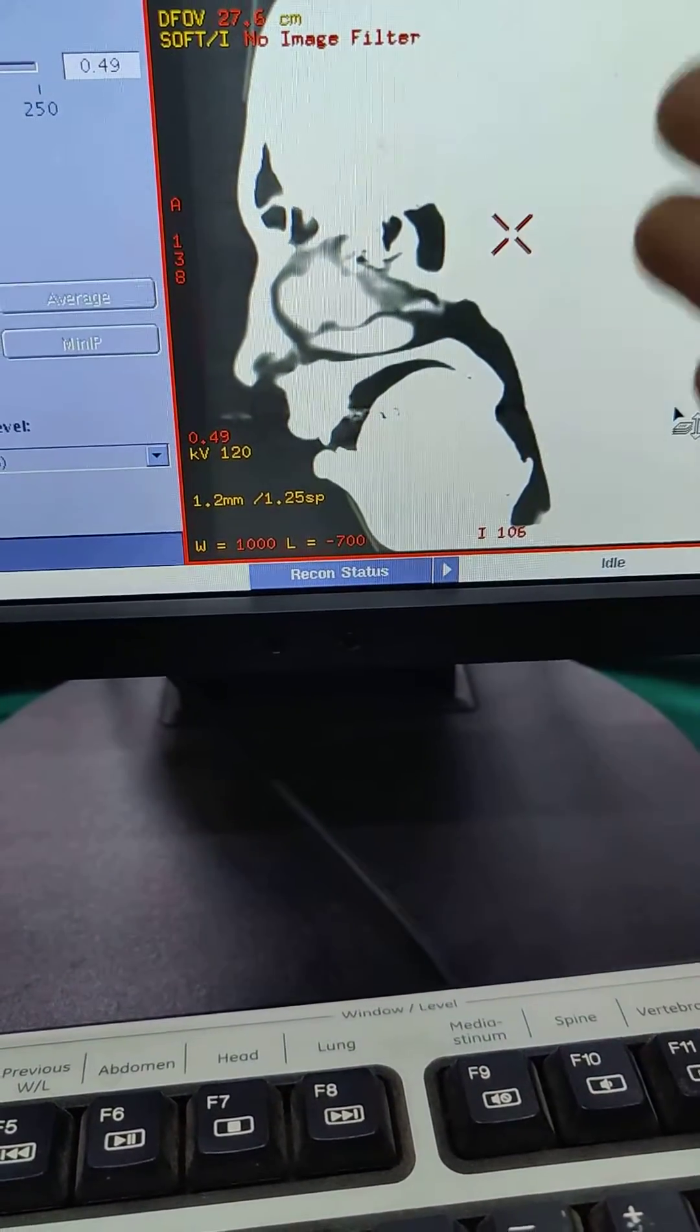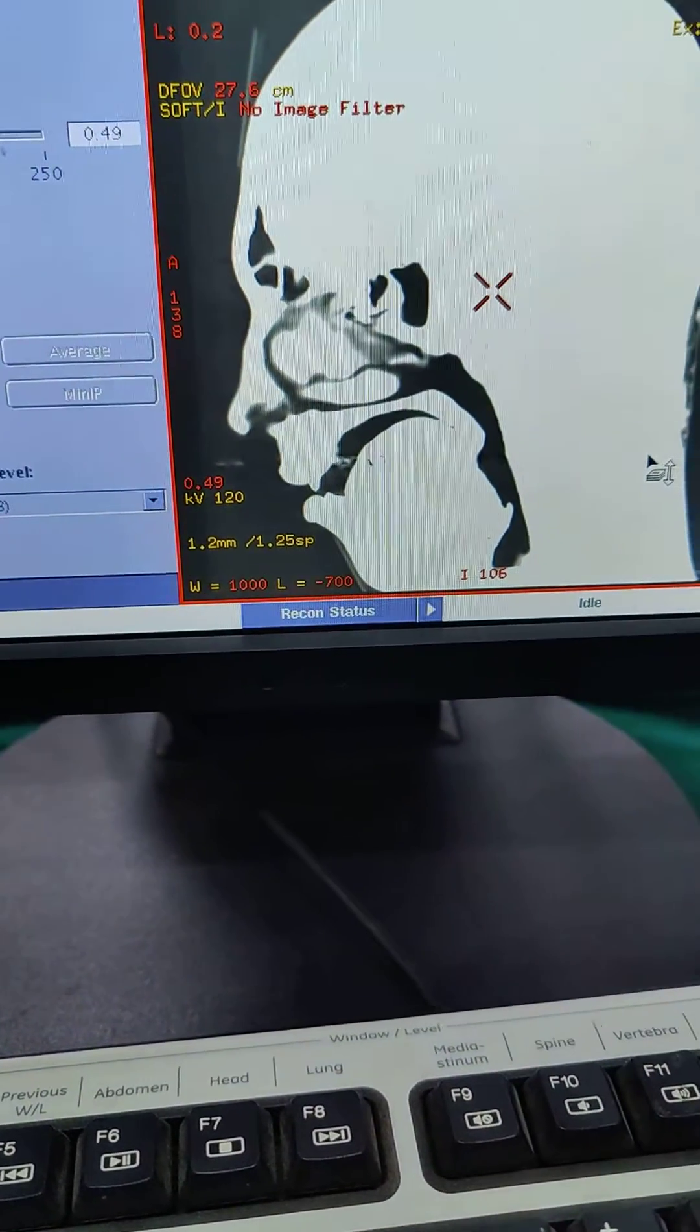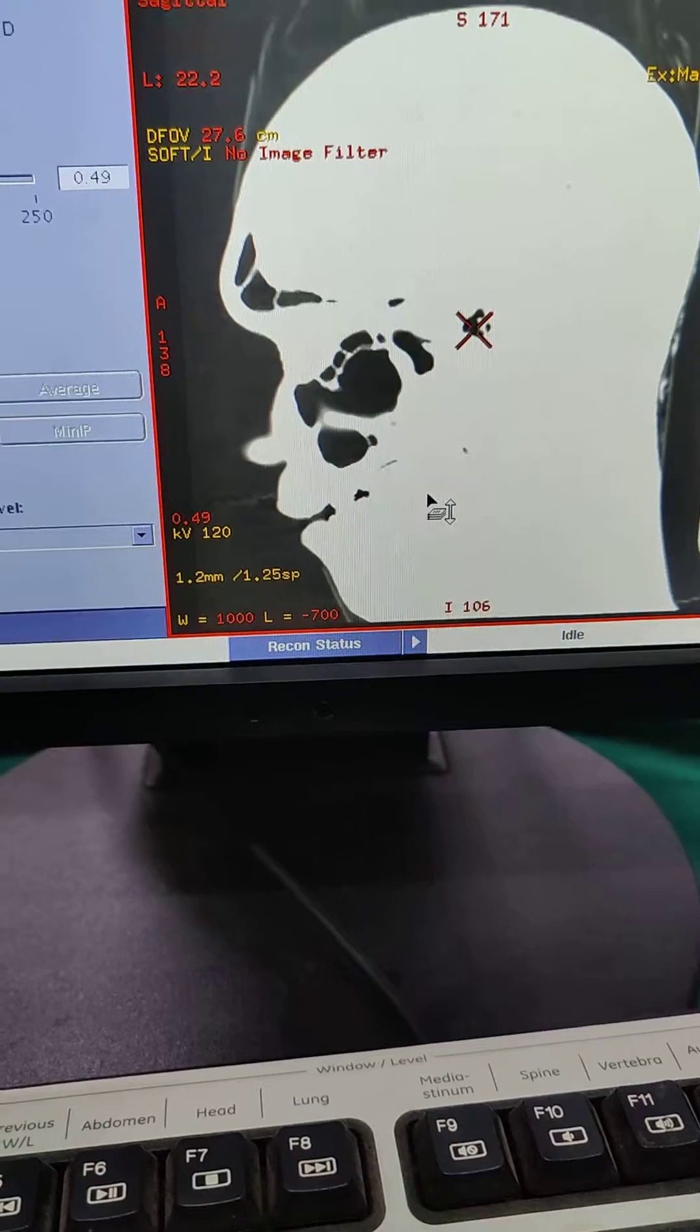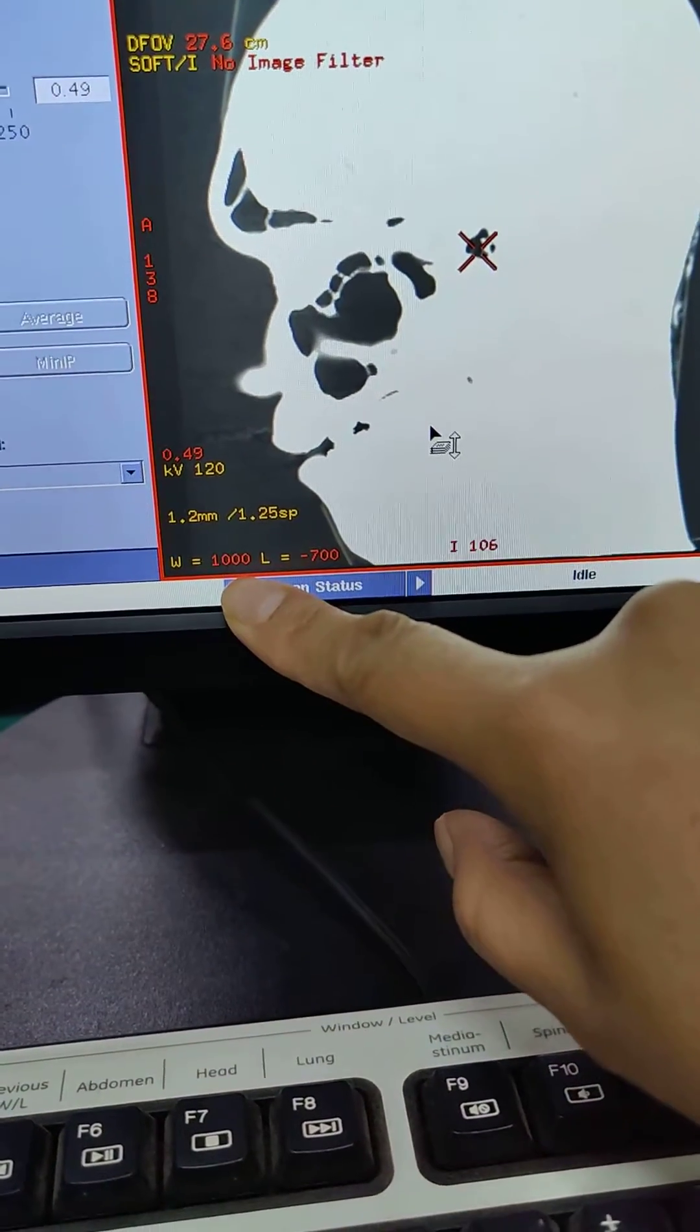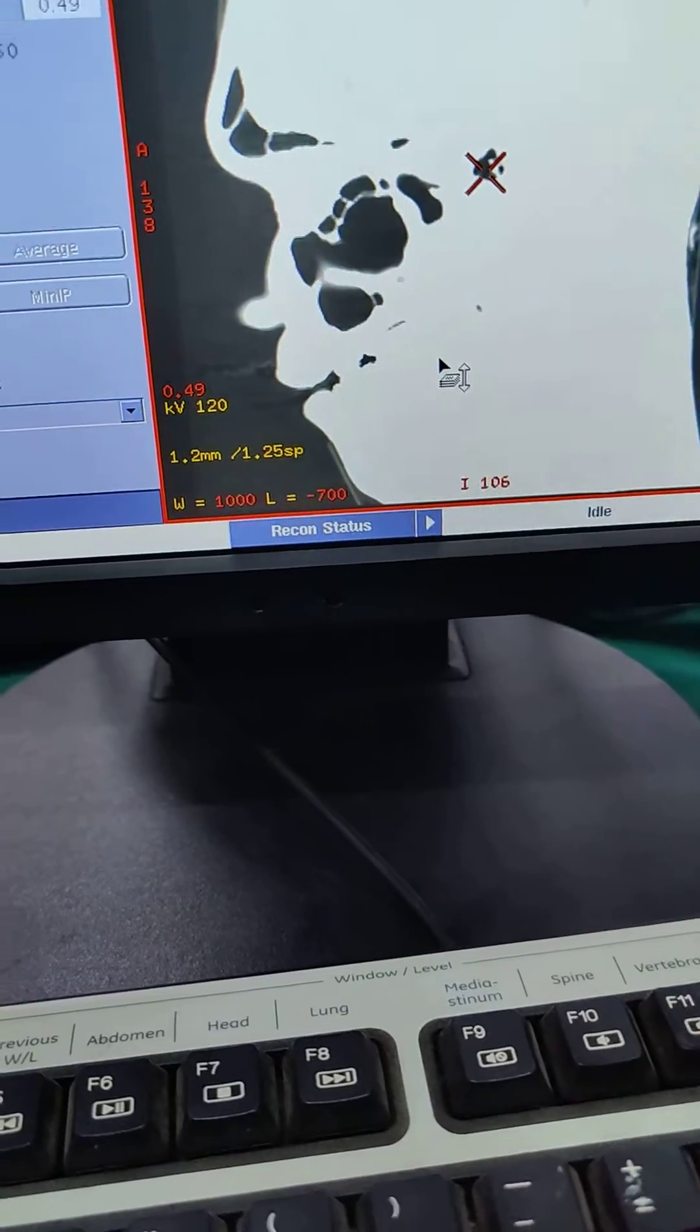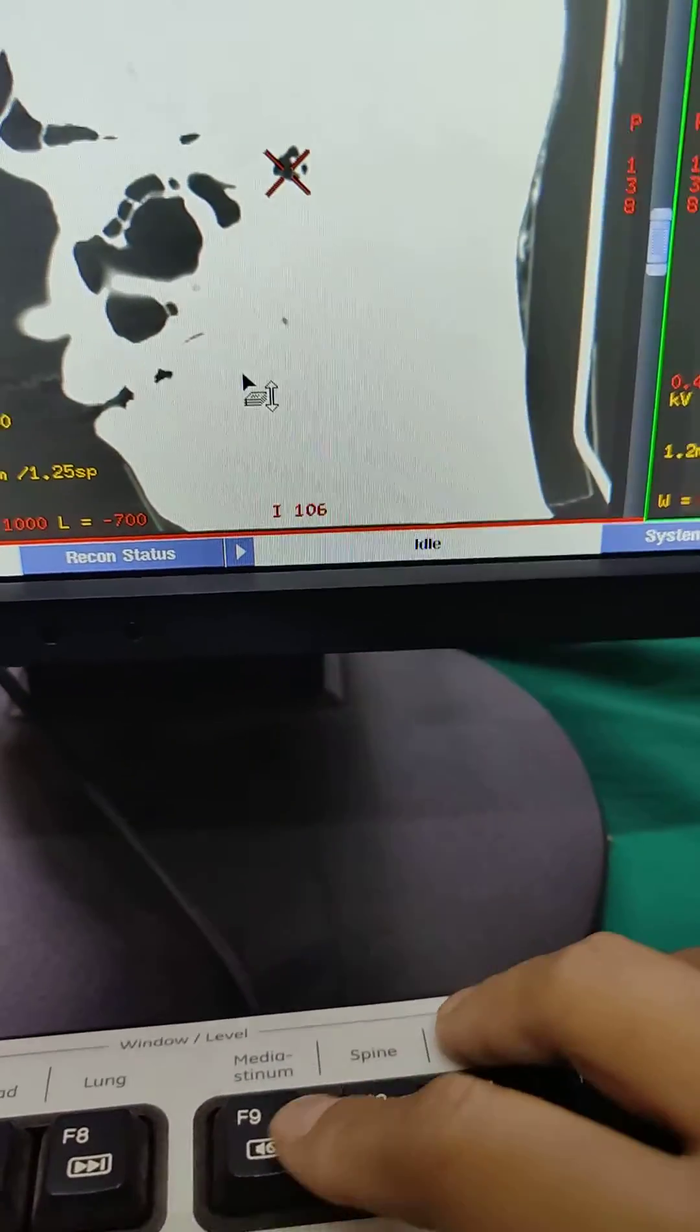Lung windows, obviously for the lungs, it's going to really have a negative color to it. You can't really see it here because it's a head, but you want to be familiar with 1000 and minus 700. So total opposite.